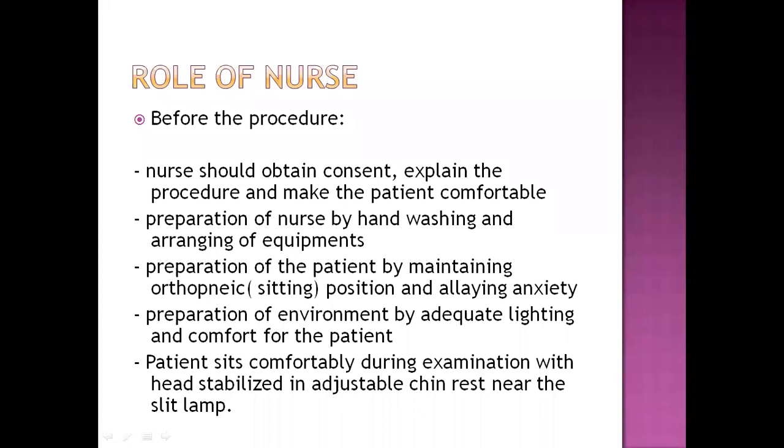Role of nurse for a slit lamp examination before the procedure is, first of all, obtaining consent, of course, explaining about procedure, steps of the procedure, explaining the patient that light source will be exposed in their eyes. They might feel a slight discomfort, but it will be for a short while, and then whatever problem is there can be found out.